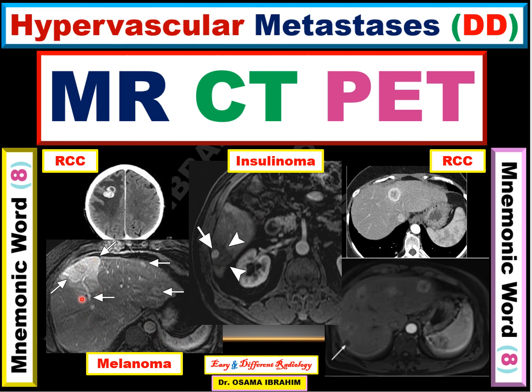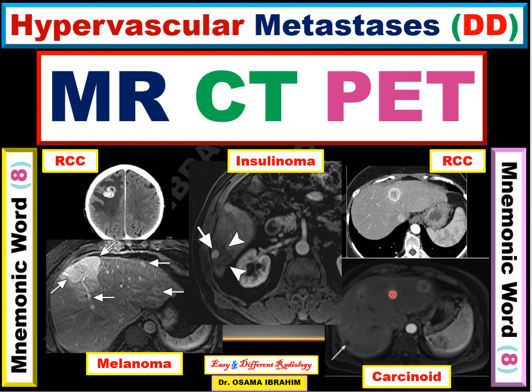This is an example of hypervascular lesions in the liver from a primary of melanoma, represented here by M. And this is another set of multiple hypervascular lesions in the liver in the arterial phase. You can also recognize the zebra spleen and the aorta showing intense enhancement. If the primary is known to be carcinoid, we should consider hypervascular metastasis from that primary carcinoid, which is also one of the neuroendocrine tumors.